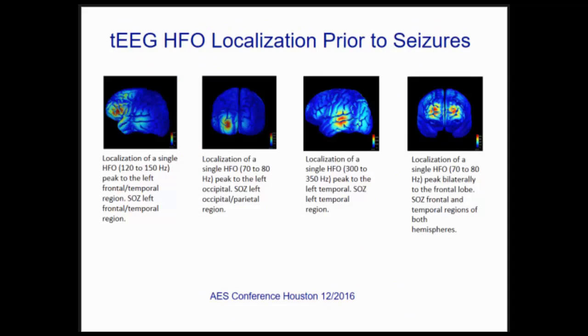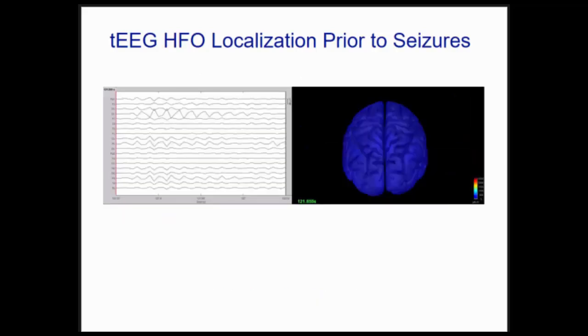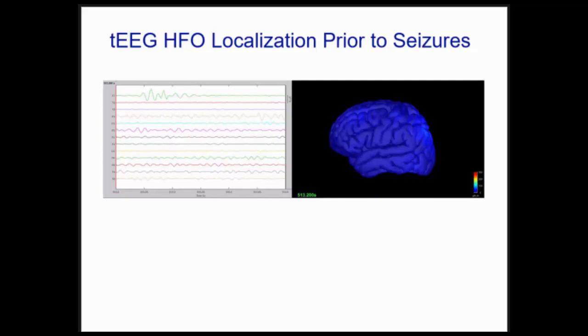And we've made real head models from MRIs of our patients and used back propagation and forward modeling to determine where the source is coming from for our potentials. And I've got a little video here of a couple hundred milliseconds, and we'll see, yes, it's going to run. So you can see we're localizing this high frequency oscillation to the visual cortex, left visual cortex. This one doesn't localize as well. This one reminds me of a lightning storm. But this is the area where it's really originating.